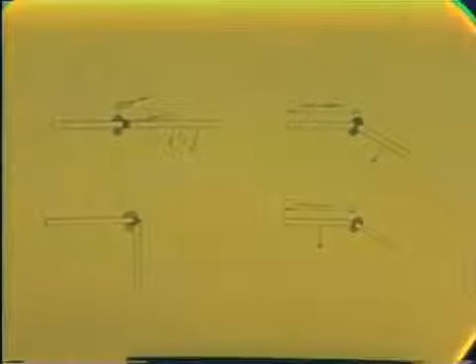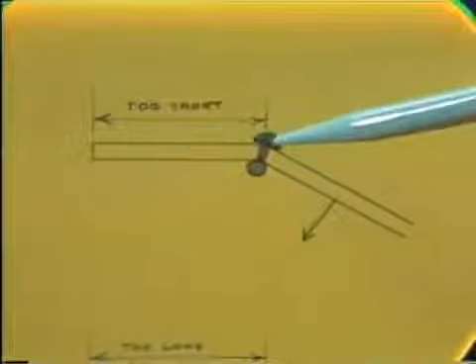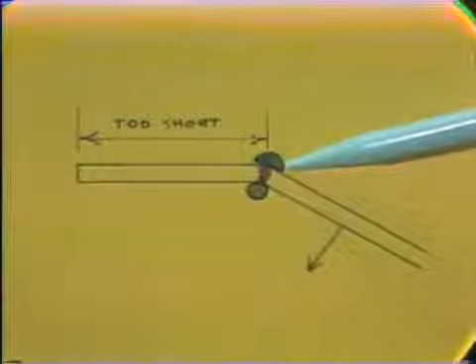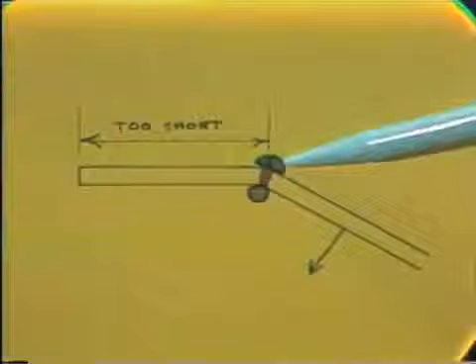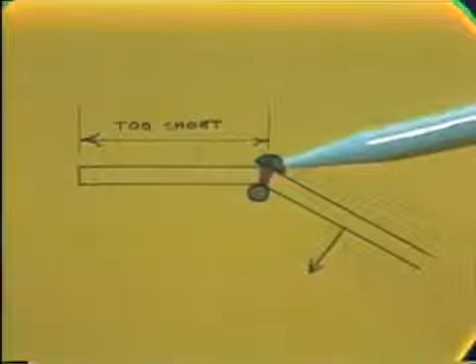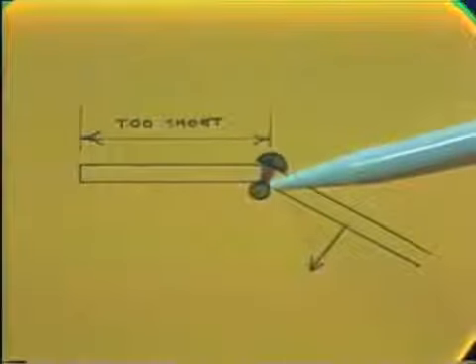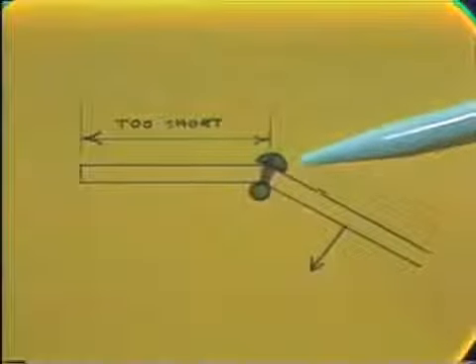Certain problems may develop as these bends are made. If your bend is started too short of the corner of the pattern, in other words, the first segment of the wire is too short, the bend might be moved down the wire by grasping the wire with the beaks of the plier directly over the mark to complete the bend. This portion of the wire then is bent around the round beak of the plier, and this will add some small bit of length to your bend.